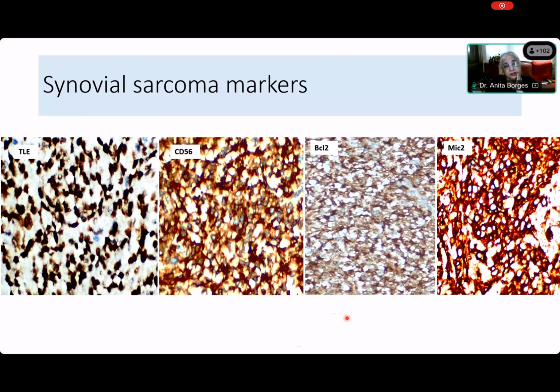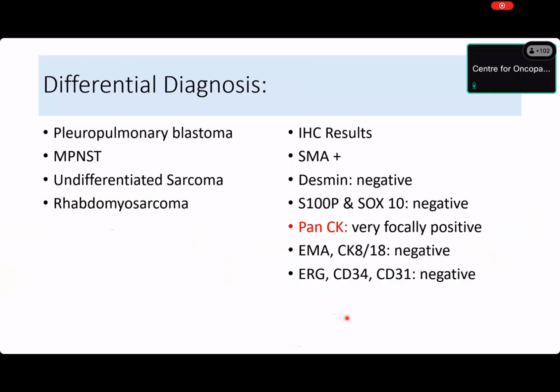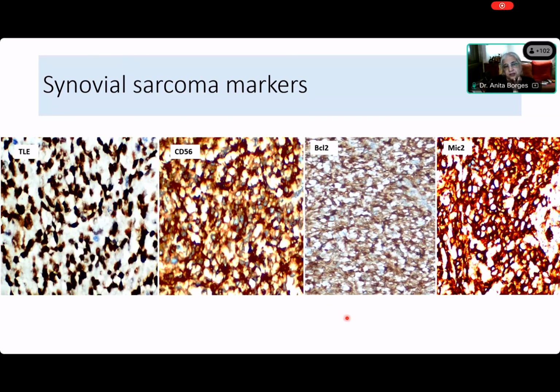Yeah, tell me, Diksha. Ma'am, slide has not moved. It hasn't moved for you? Has it moved for everybody else? Yes, it has moved. Yeah, it has. Okay. Yes. So now, Diksha, has it moved for you? Yes, ma'am. Okay. So then now is it a synovial sarcoma? Yes, ma'am. TLE1 is diffuse.